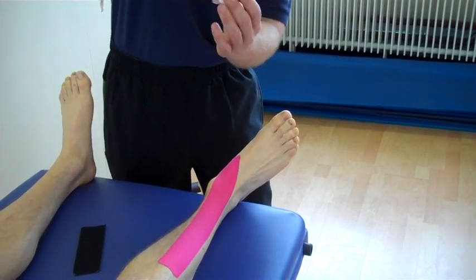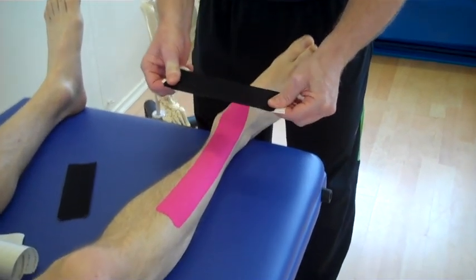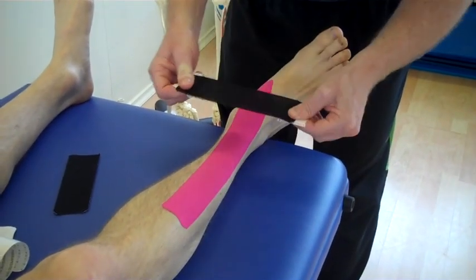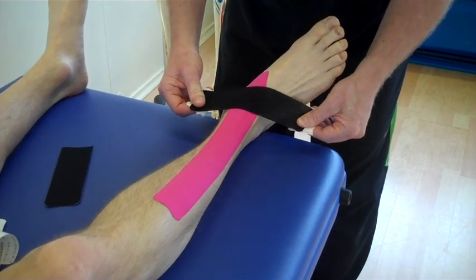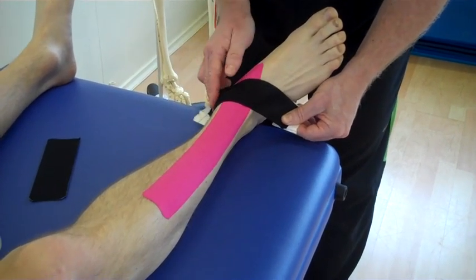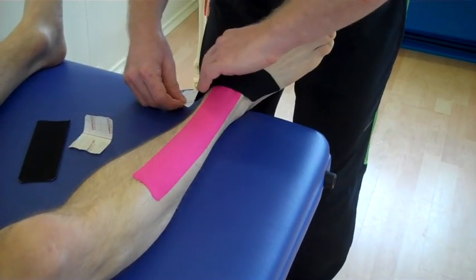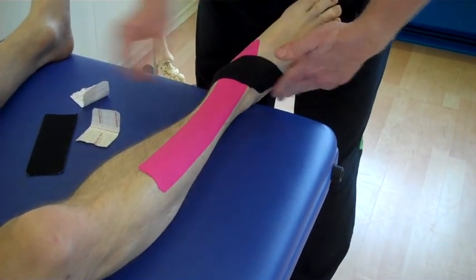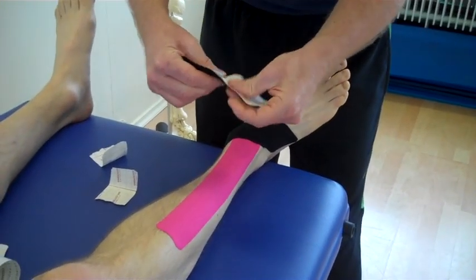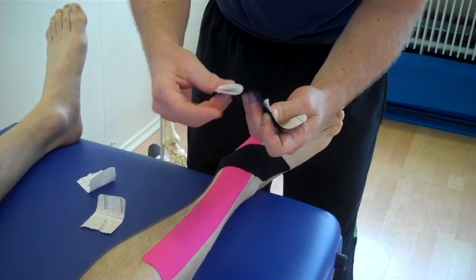Peel back as shown, and this time we're going to put maximum stretch onto the tape. If the pain was located here, we're going to come across — think about an X — we're going to form an X shape, come across, then literally feed out the last bit with no stretch on the tape at the ends. And again split the tape into two, peel back the tape and hold on.